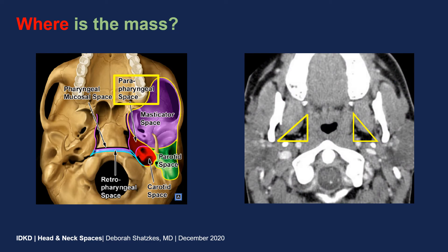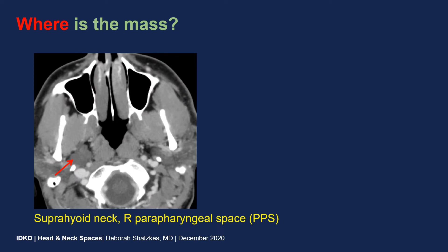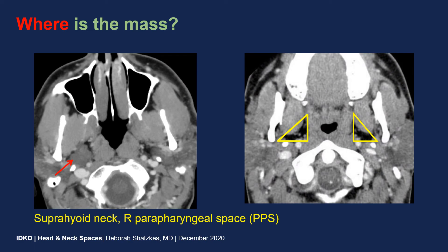If we look at a CT image, the parapharyngeal spaces are triangular-shaped, fat-containing spaces lateral to the pharynx. We can see muscles of mastication, the pterygoid muscle anterior to it, and then the parotid space posterolateral to it. Going back to our image, we can see that this lesion is actually lying in the parapharyngeal space — lateral to the nasopharyngeal mucosal space, medial to the parotid gland, and behind the medial pterygoid muscle. So we're going to place this mass in the suprahyoid neck and the right parapharyngeal space, abbreviated as PPS.